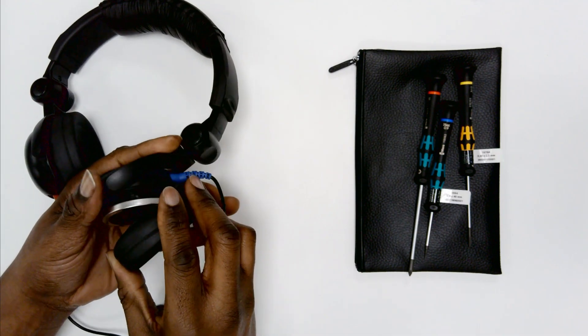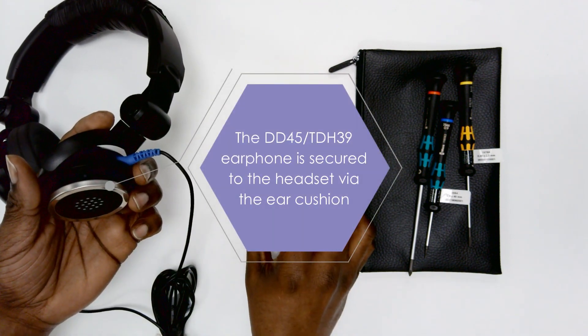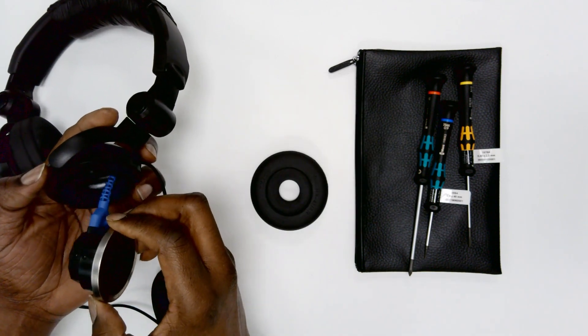Carefully remove the headband from the existing headset. The earphone is secured to the headset by the ear cushion. Remove this and put it aside as we'll reattach it to the earphone later.